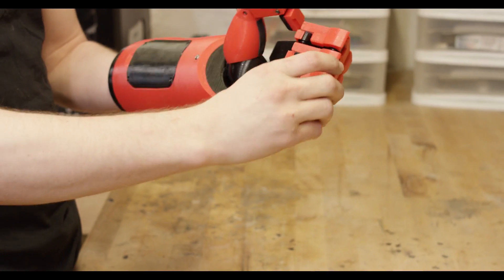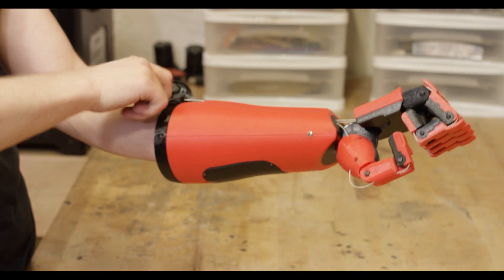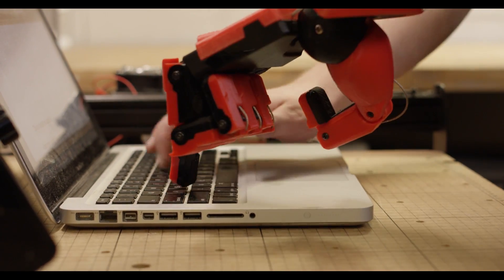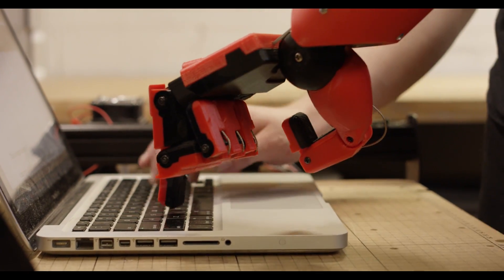The main feature of the hand is a steady grip, but hands are made for more than just gripping objects. As a secondary feature I incorporated a separate pull system for the index finger which can be tensioned and locked so that you have a point, and this would be more useful in applications such as pressing buttons, typing, poking your neighbor, or whatever you want to do.